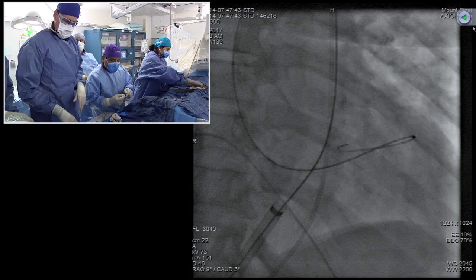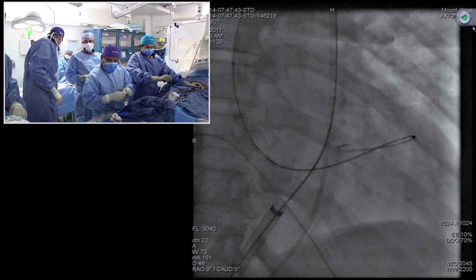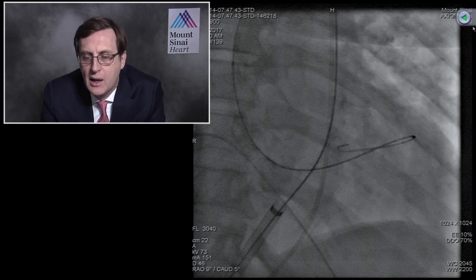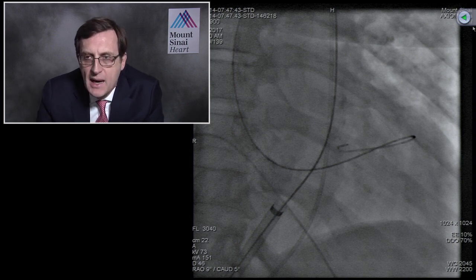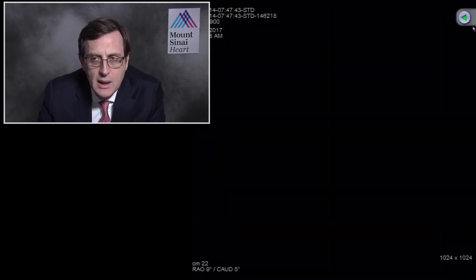George, you wrote the editorial, I mean, the meta-analysis last year in JACC Interventions. Yeah, we have to be very clear about that. The number one issue with embolic protection devices is the safety. You have to be able to place them there in an easy and safe way. You cannot struggle there. Why? Because data are somewhat positive, not the super positive anybody wants, and they're the foundation of the devices, and also I think for the approval, that's what happened.